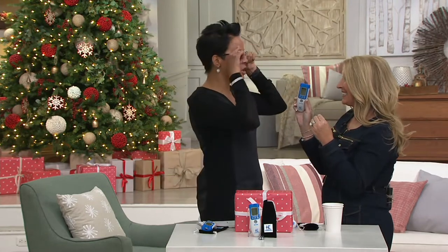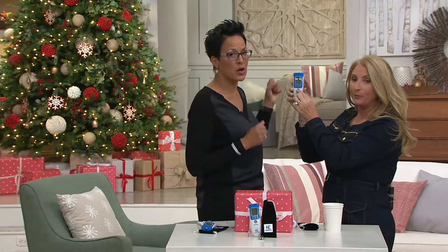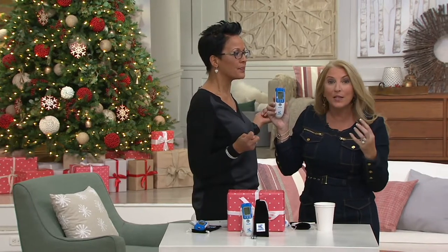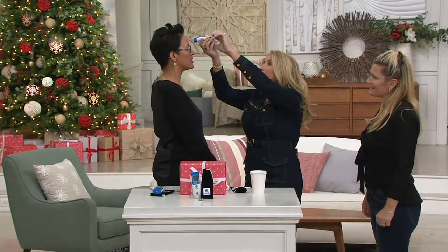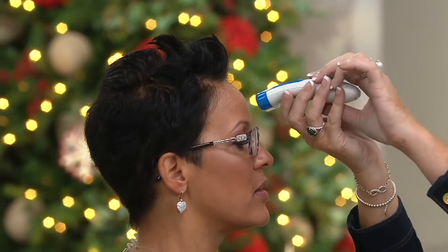Can you show one more time a little bit closer, to show how you are really not touching my skin? When we say no touch, we come up to the forehead — so we're not cross-contaminating. Actually, Megan, can you come over here? I want to show everybody — maybe there's a germ in the air because you're going to use the thermometer when people are sick, when there's germs in the air. So I'm going to take Rachel's temperature, about an inch from her forehead, and she is nice and healthy.